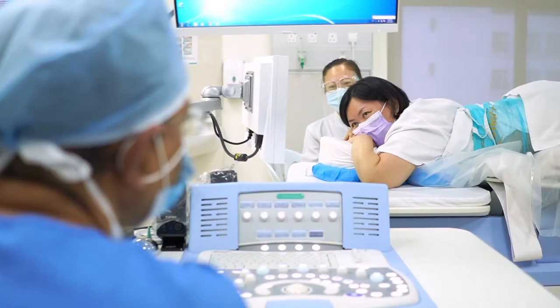Mild intravenous sedation will be given. Then we will perform the HIFU surgery. The patient will be awake throughout the surgery. After the surgery, she will be rested in the prone position for 2 to 6 hours. She will be able to have light refreshments after about 2 hours. She will be discharged the next day.